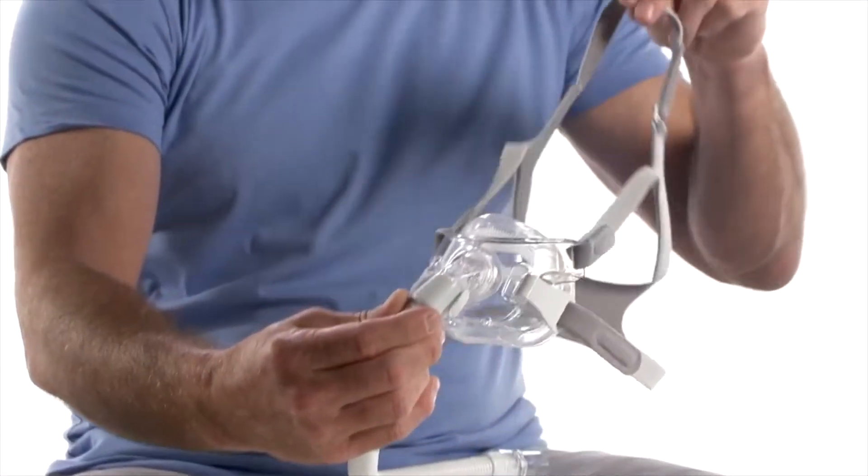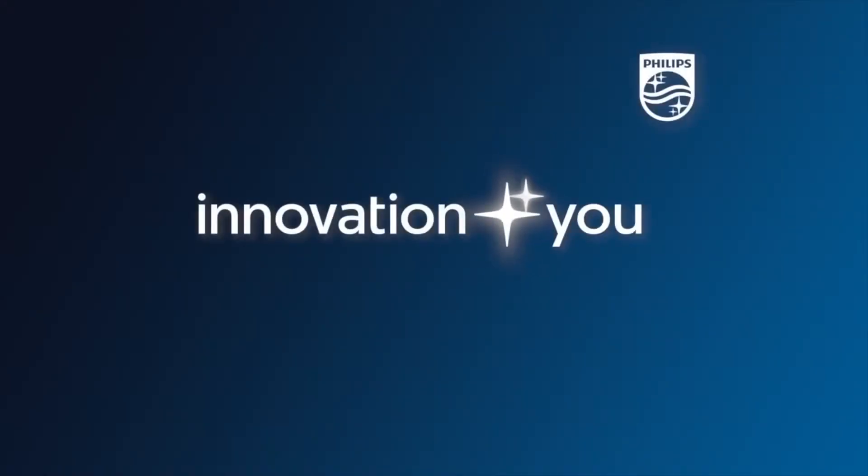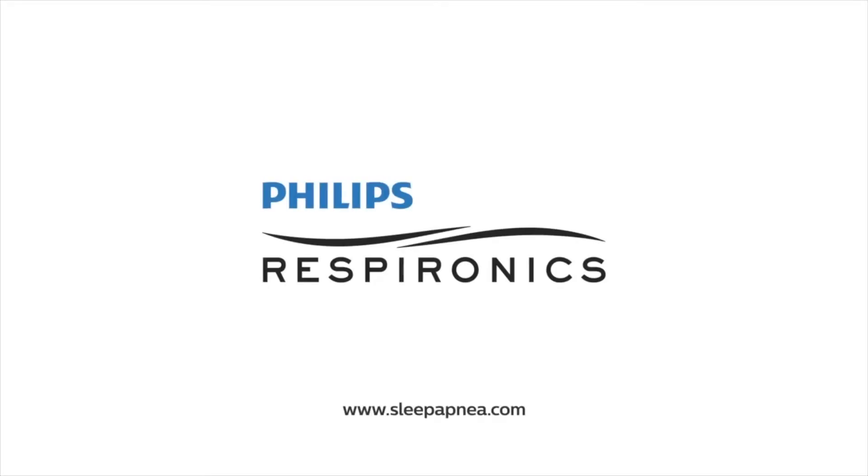The AmaraView mask is now fully assembled. Innovation in you. Philips Respironics.